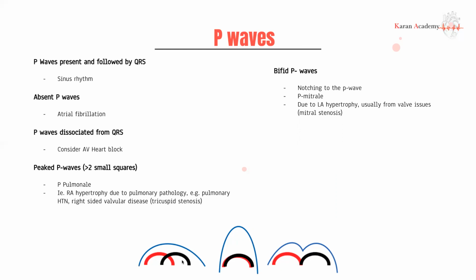Okay, so what does the P wave represent? The P wave represents atrial depolarization. Be clear on that, right? Most of that depolarization is going to start off in the SA node, which is going to be on which side of the heart? Hope you know. The SA node is found in the right atria.